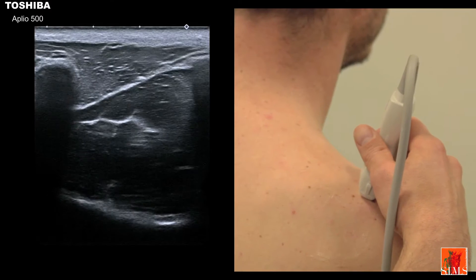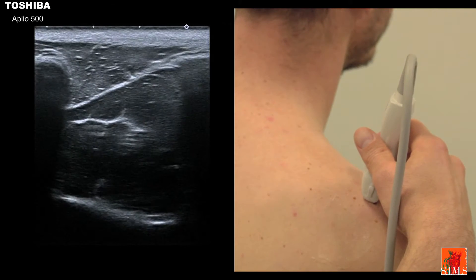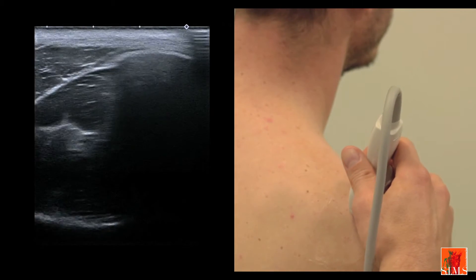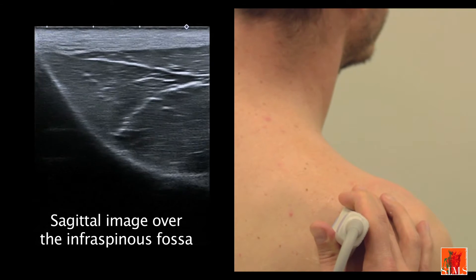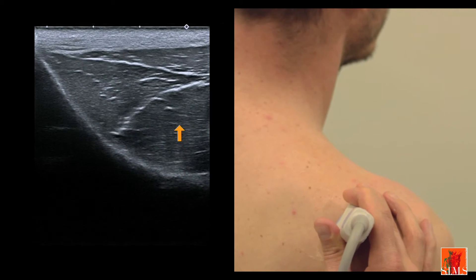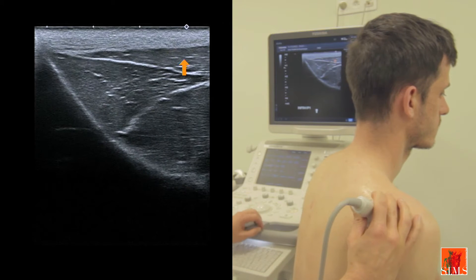In order to obtain a fine sagittal view of the infraspinous fossa, let's start from the sagittal view of the supraspinous fossa that we looked at a minute ago. Then we move backwards over the spine of the scapula and follow this beautiful bony slope that we see deep to the image, which corresponds to the floor of the infraspinous fossa. Superficially, we can observe the curve of the infraspinatus muscle located deep to the posterior bundle of the deltoid muscle.